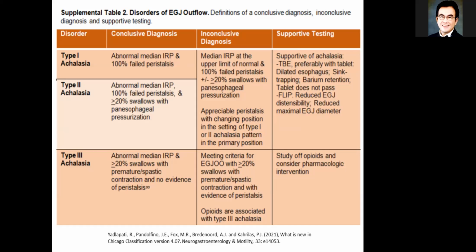And I do think that this is a very positive development, because sometimes when we are doing provocative testing, we must always remember to ask for symptoms, right? So if during the provocative testing you found a hypercontractile peristalsis along with symptoms, I think that will be more clinically relevant, isn't it? So that will be one: always correlate between symptoms and your manometric findings.